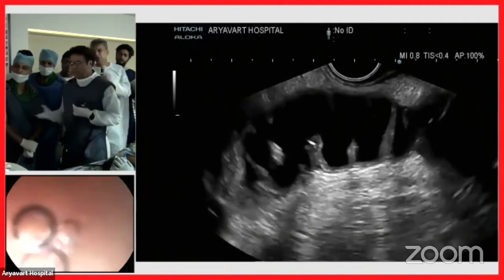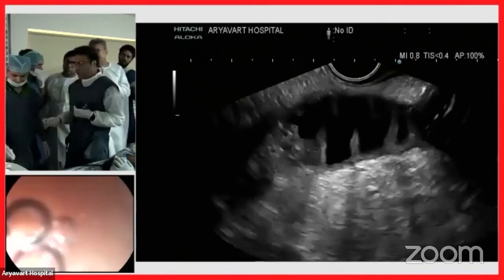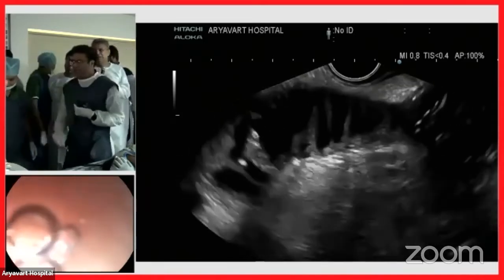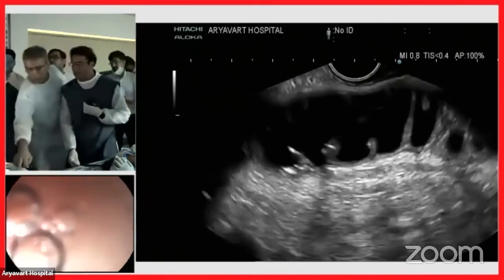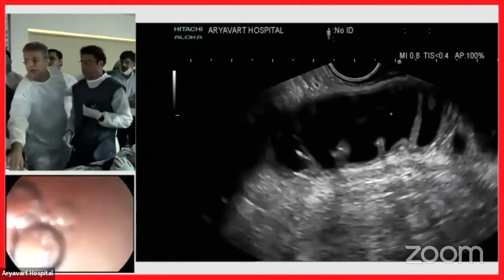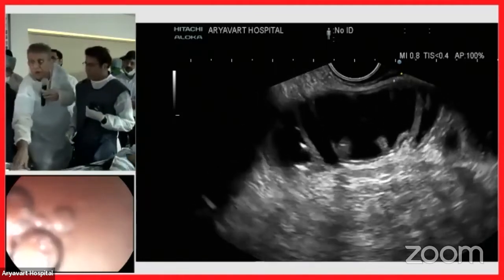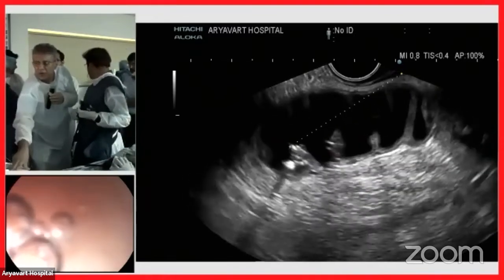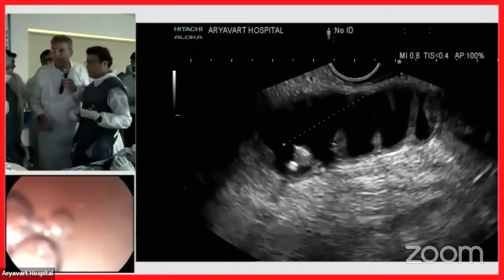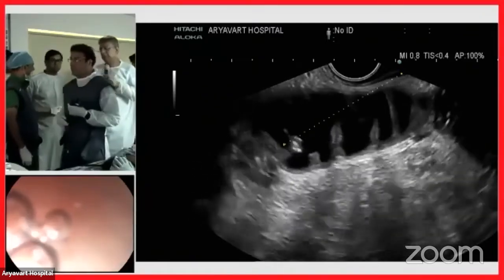So you are saying this is not vertical, it has to be oblique. Yeah, now this looks okay. Because from here, the needle will come out from here, and what I have to do is the device. Give me the device, please. Device. Flush with fluid first.